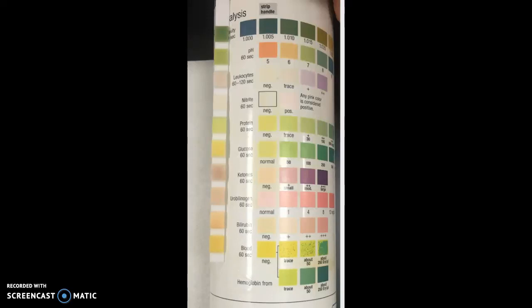So this is a urine test strip, and what you see when you're looking on the screen is the test strip on the left, and the bottle with the measurable amounts is on the right. So the strip has been dipped in urine, and the color of the pad changes if you have something in your urine that you can detect.